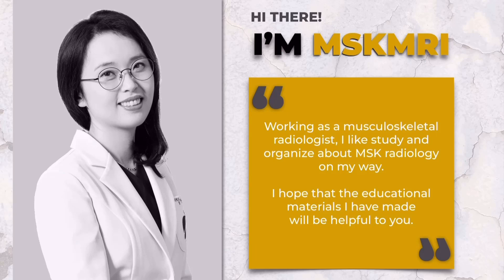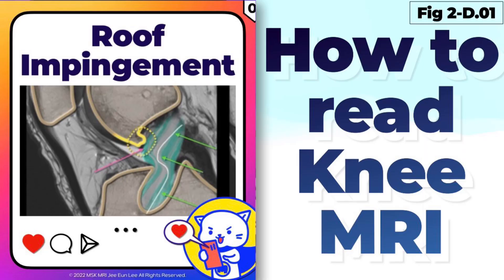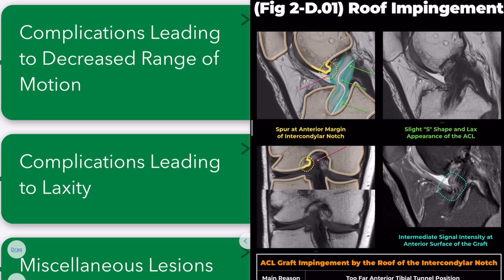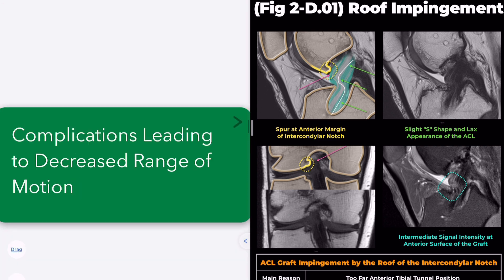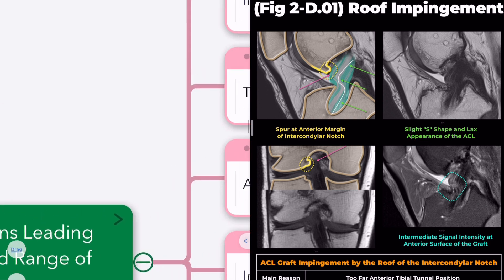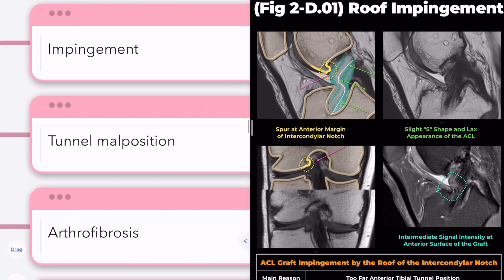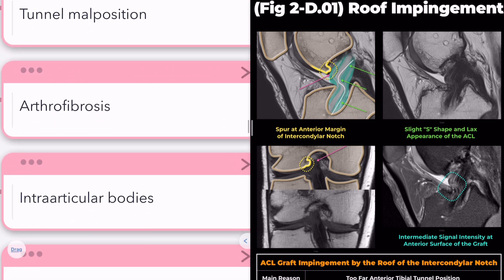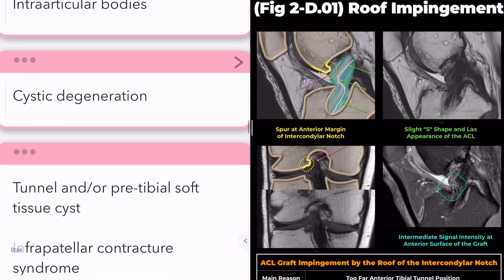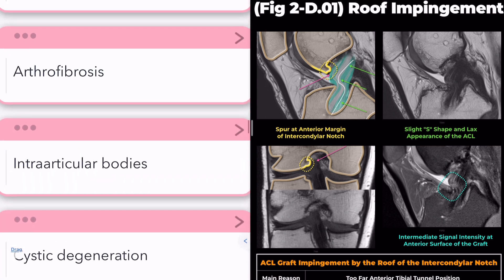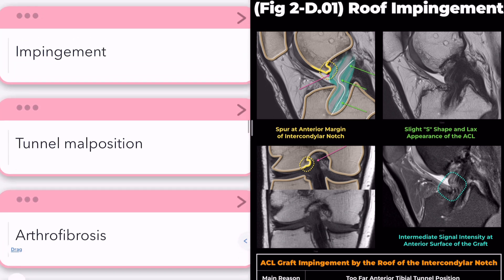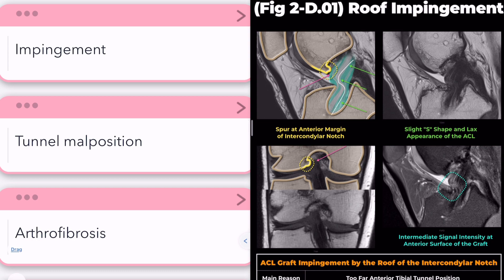Hello, I'm Zhiyunee from MSK MRI. The main complications seen after ACL reconstruction procedures can be broadly divided into two groups based on clinical symptoms: decreased range of motion and laxity. Impingement and arthrofibrosis are the main complications in patients with decreased range of motion. Less common causes include intraarticular bodies and ganglion cysts. Today, let's focus on impingement.